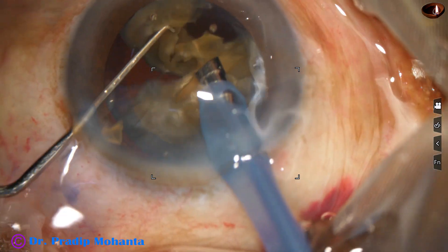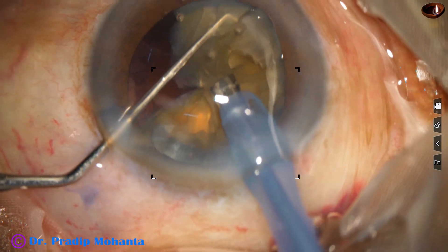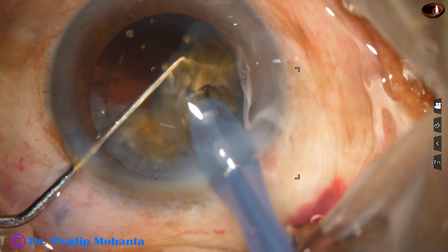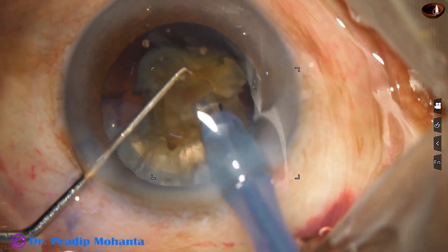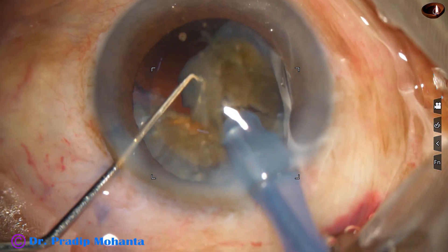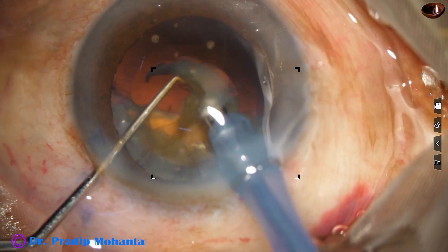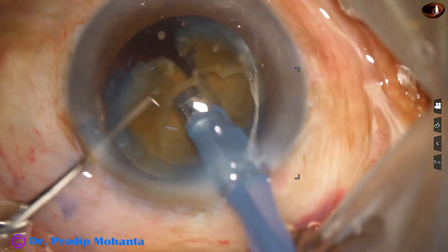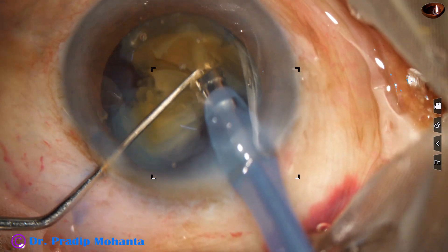Emulsification of the pieces is in progress. This is the last piece of one heminucleus. Whenever a fragment is large, we subdivide it into smaller pieces and emulsify. You can see that no free fragment is going upward and hitting the corneal endothelium — this is the way to protect the corneal endothelium.